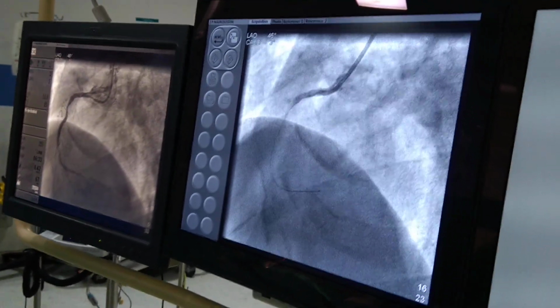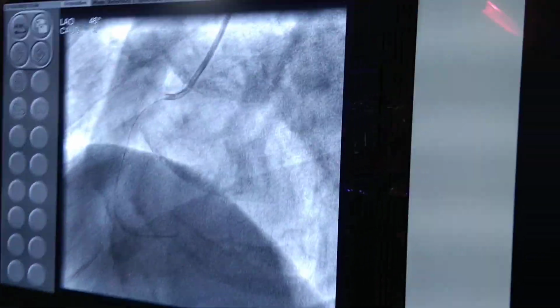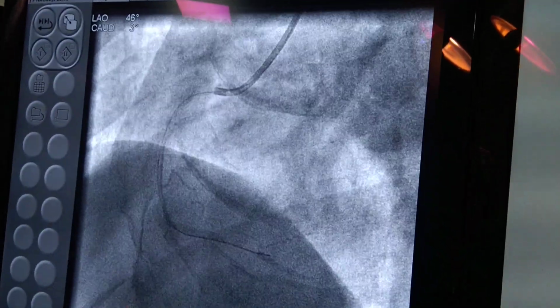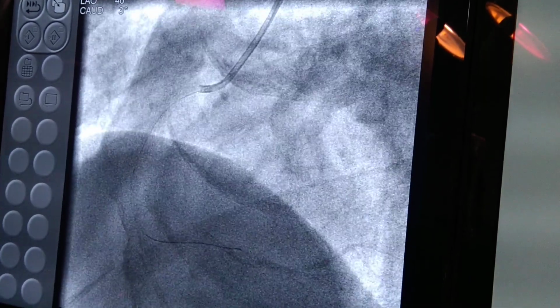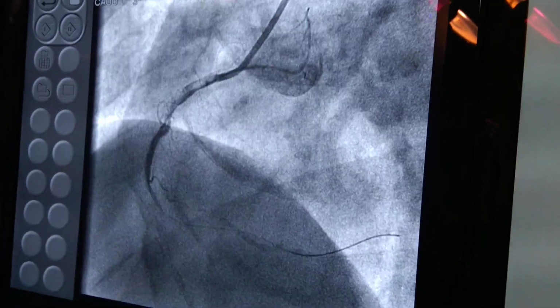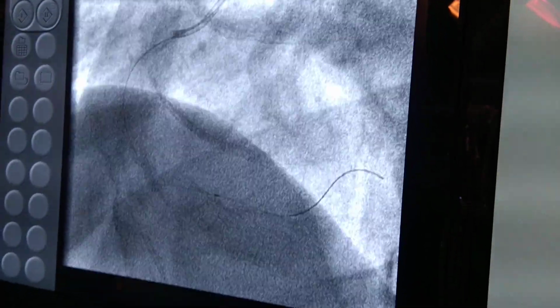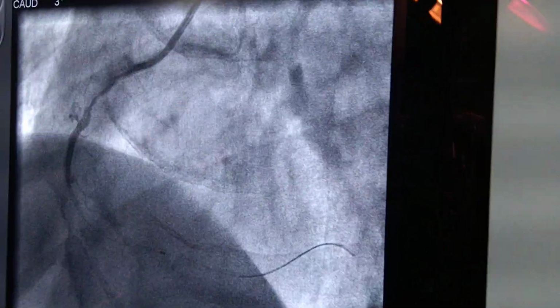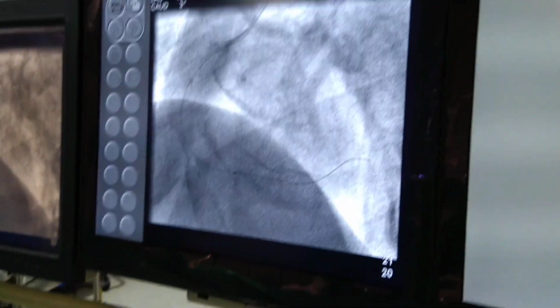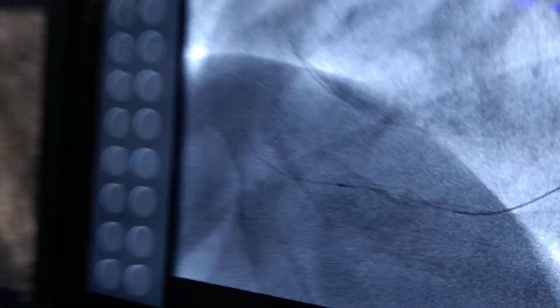Whenever we start the procedure, we would like to know the stent size, and we always use the 30mm dark segment of the Whisper wire to find out whether a 38mm stent will be enough or not. We planned 2 stents from the beginning, and once the wire was there, we did the pre-dilatation with 1.5mm. Good pre-dilatation is very, very important.